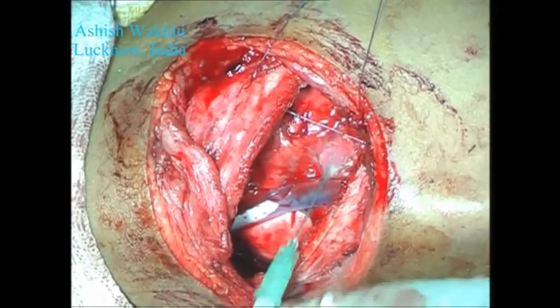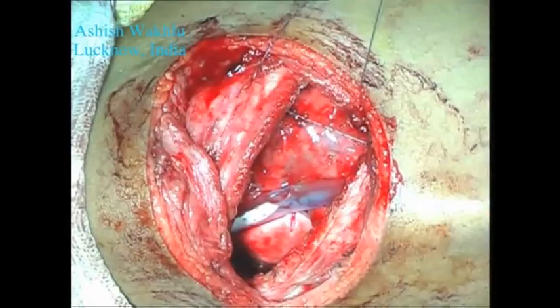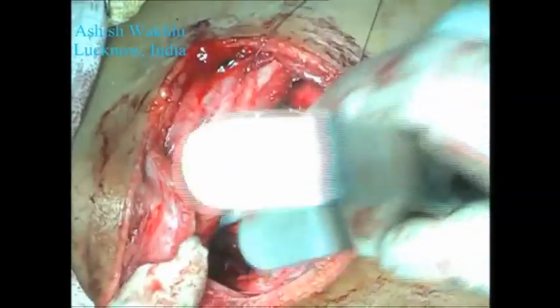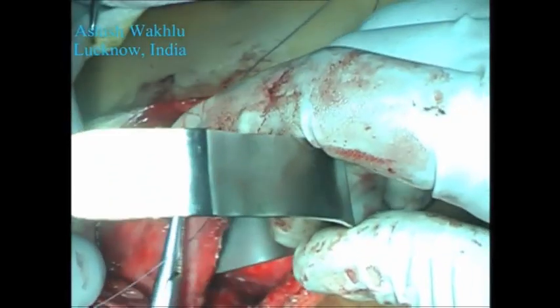A little more tissue glue was infiltrated at a site on the lung from where some air leak was seen. However, since this is a non-infective leak, we expect it to close off pretty rapidly in the post-operative period.